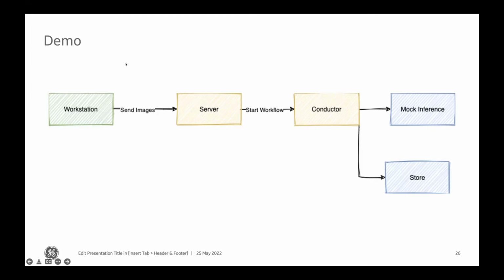What I want to do here is I'm gonna have, let's say, a workstation. I'm simulating a medical workstation. For this, I'm using an open source project called Horus that can show me, it's like you are in a hospital and you see all the images, you can see the patients and things like that.